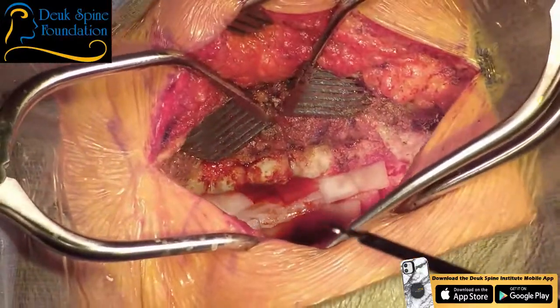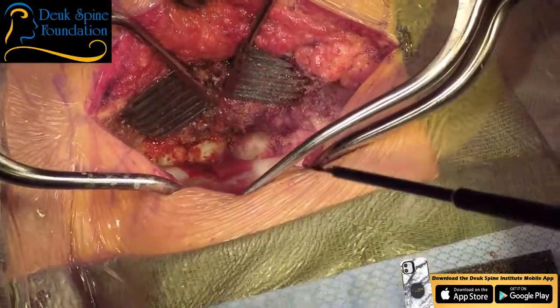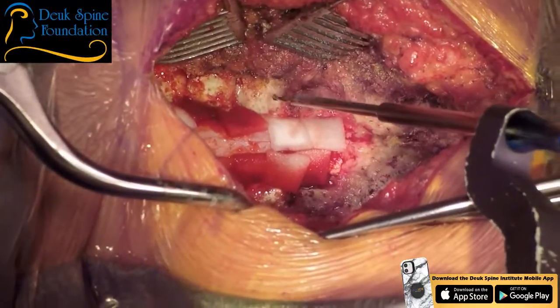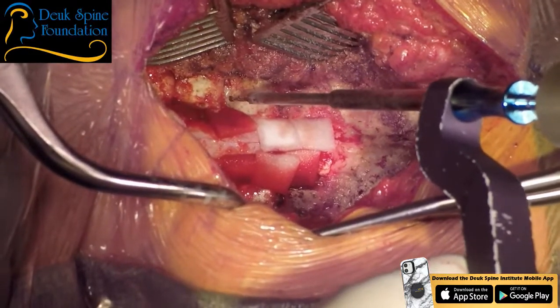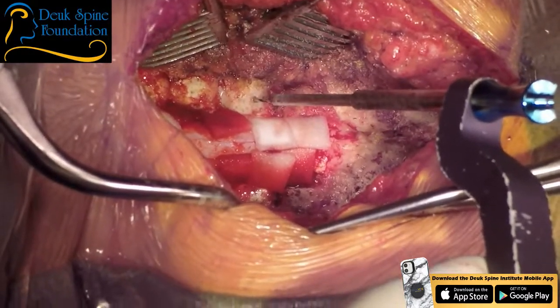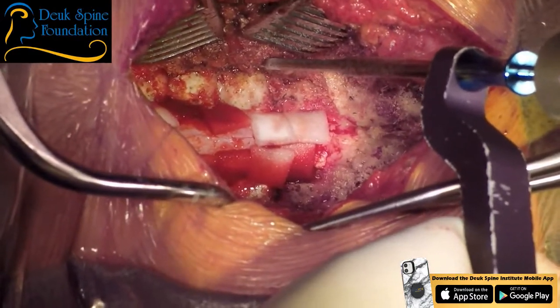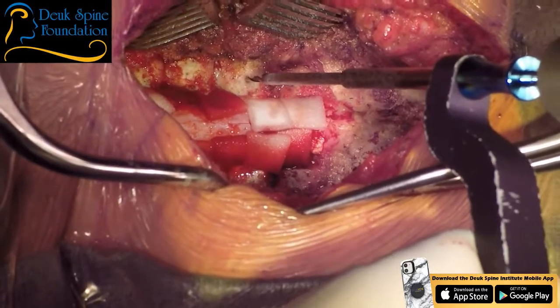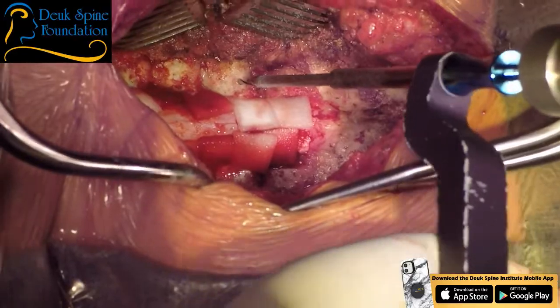So we're going to put in what are called lateral mass screws. We're going to drill a pilot hole. I always start, I'll use this lateral mass for example. You look at the facet joint here at the bottom. You look at the facet joint here at the top. You basically go to the center of the lateral mass, medial to lateral. You guys remember, we did the exposure all the way lateral. Bottom to top, you find the center, and then you cheat a little bit inferior by a millimeter and a little bit medial by a millimeter.